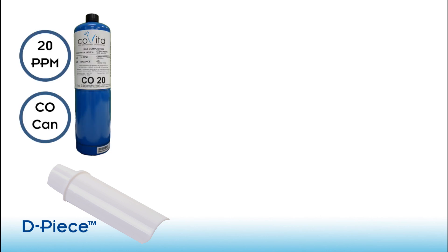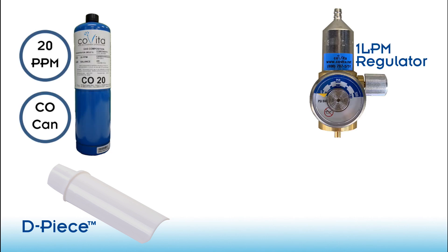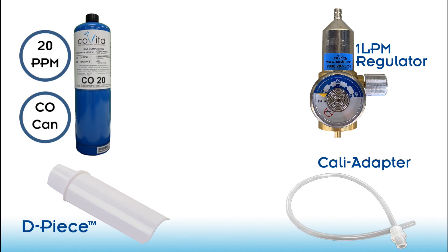Before we begin calibration, we will need a D-piece, a 20 ppm carbon monoxide calibration can, a 1 liter per minute regulator, and a Cali adapter, along with your monitor.